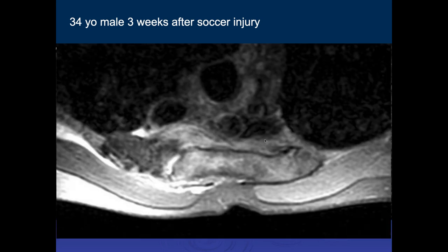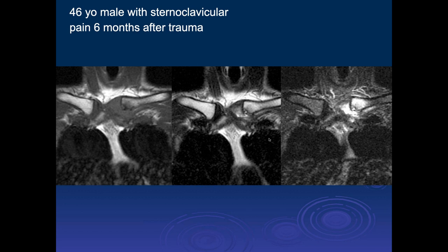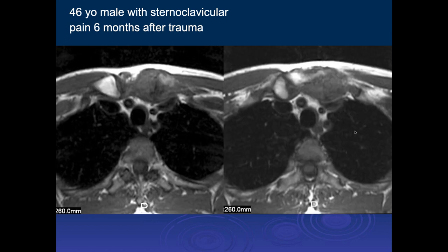You can see trabecular contusion involving the sternum itself — this is an area that can often be quite painful. Here's the axial image going through that same area. It's been painful for a long time. A 46-year-old male with sternoclavicular pain six months after trauma. There's a lot of edema in the proximal aspect of the left clavicle and probably at least partial dislocation of the sternoclavicular joint with significant surrounding edema and capsular thickening. We need to look at the posterior vasculature — I don't see a big mediastinal hematoma.